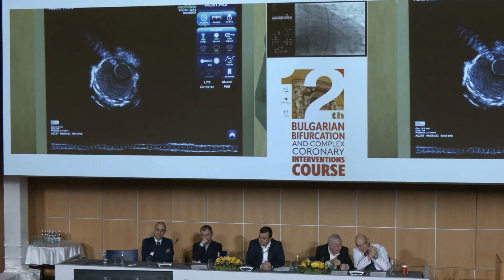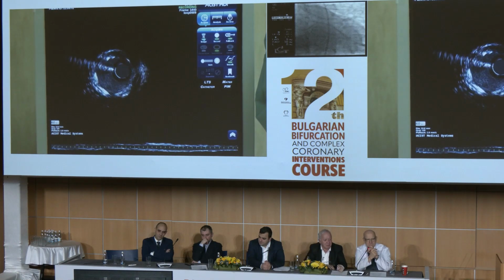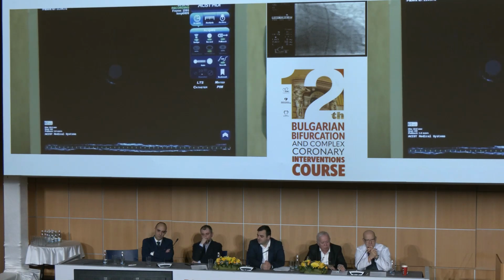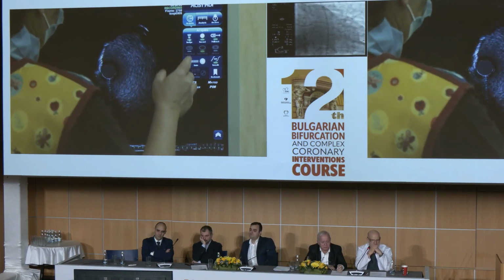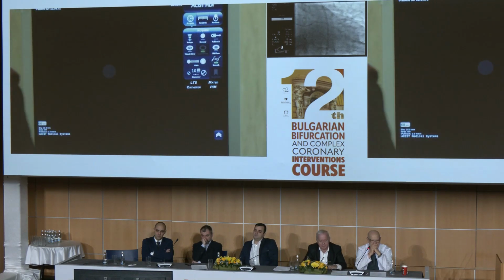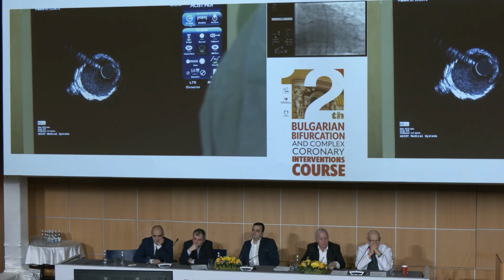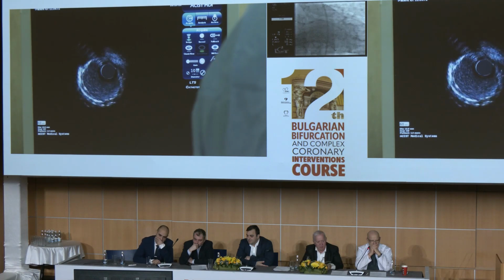Just to see how it looks, the proximal part, the notion of Dr. Alexandrov. It's excellent. Yes, there is a small edge dissection, it's true. Can you give me the live image again?